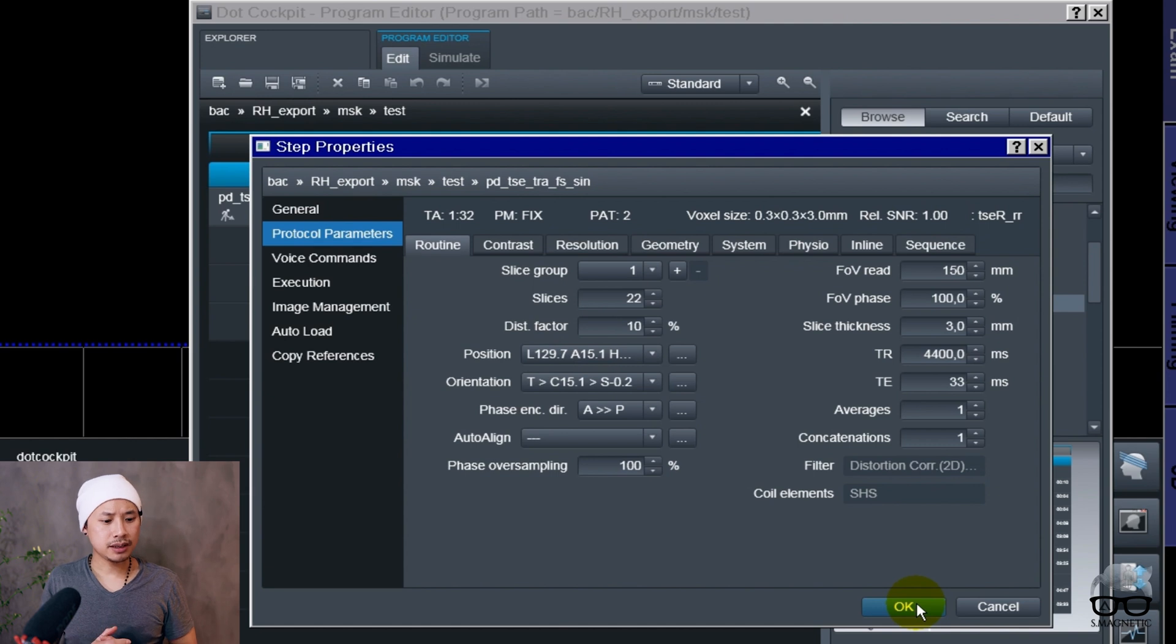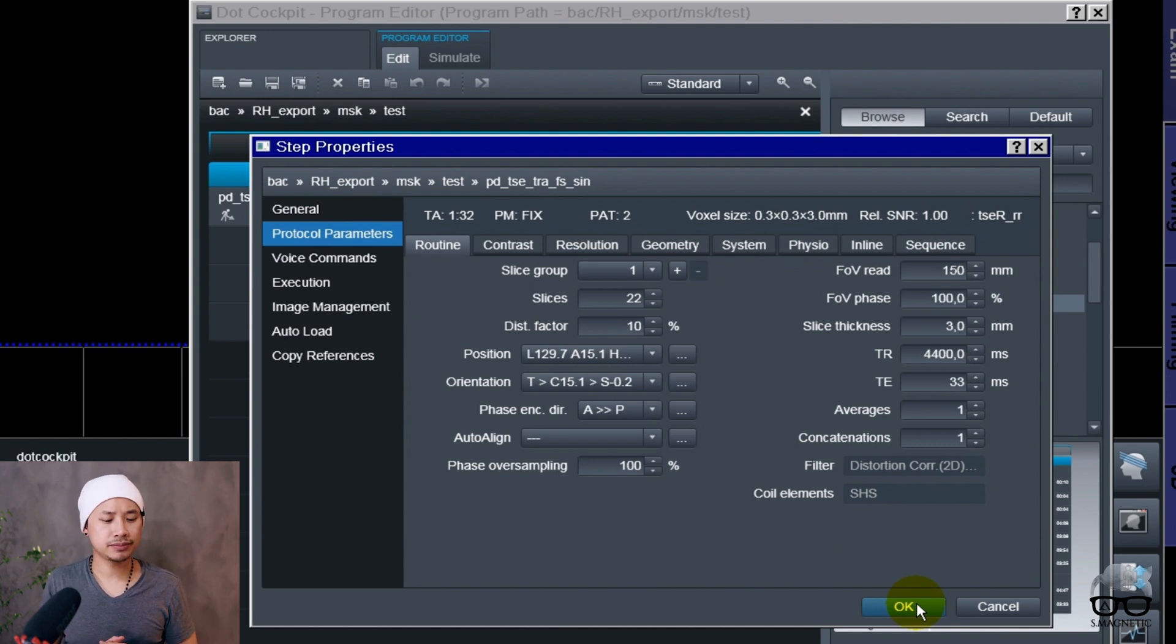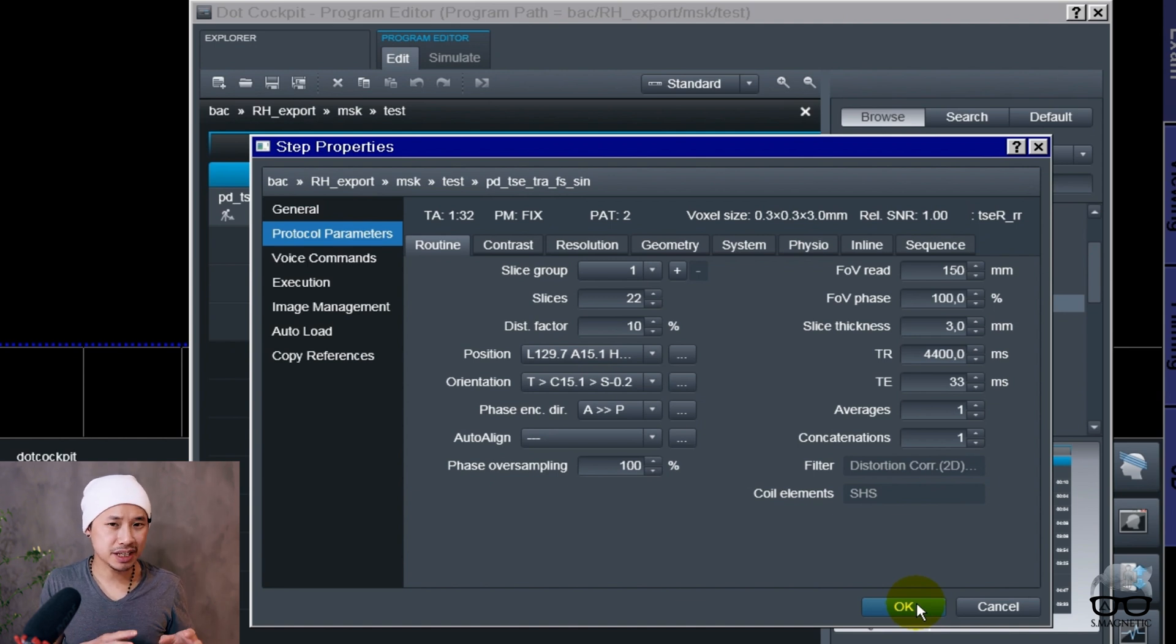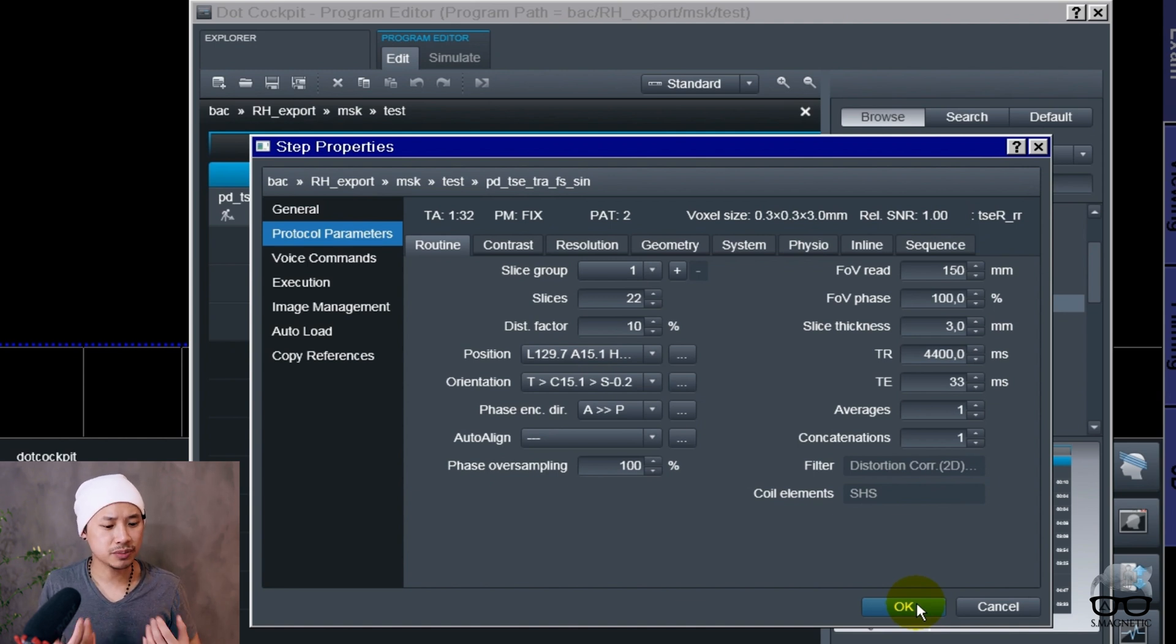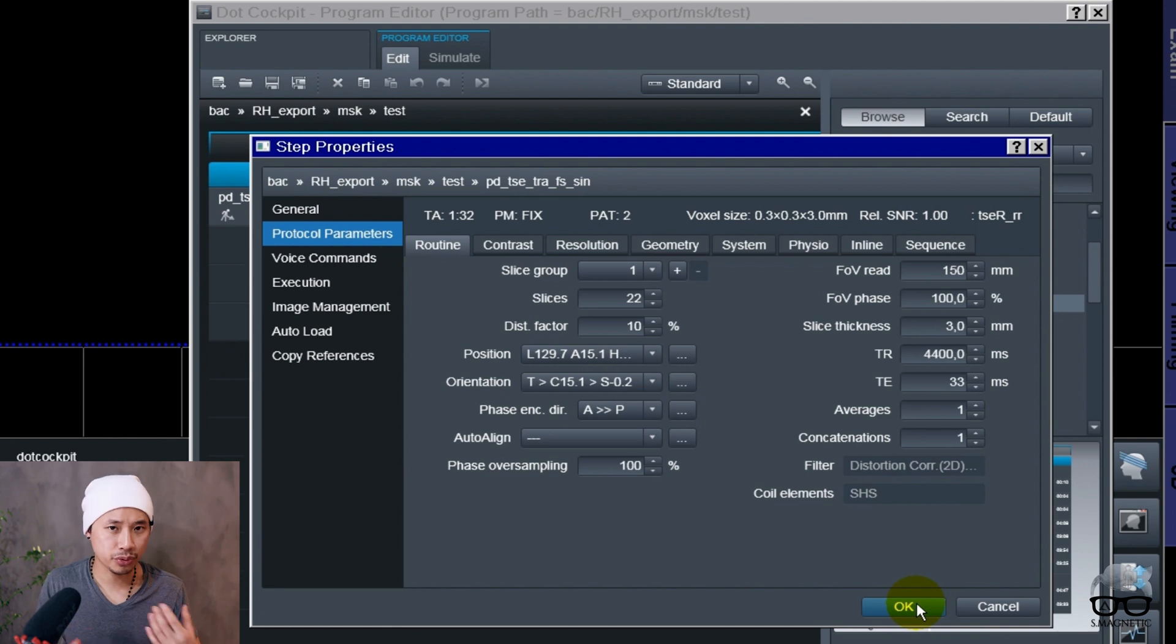Now I could just rename to sinister left, and then suddenly voila - it's the orientation, the position to the left side now, and it also remembers the coil elements and everything. This can be done without having the patient inside the scanner. It's much faster, much more efficient whenever you're doing the protocols.